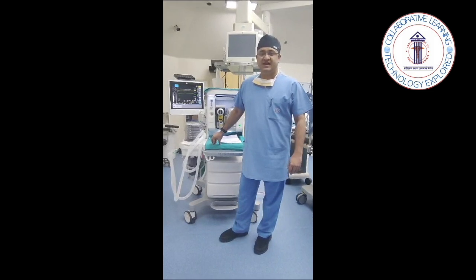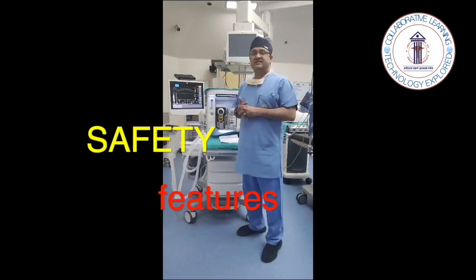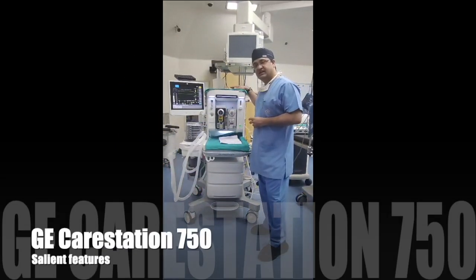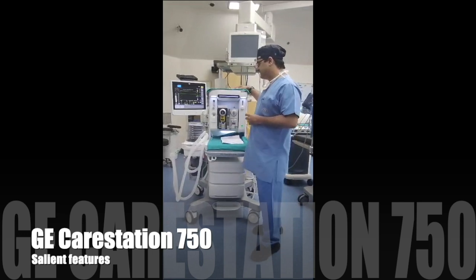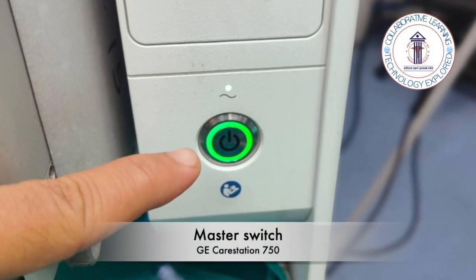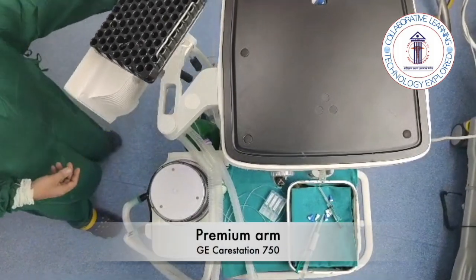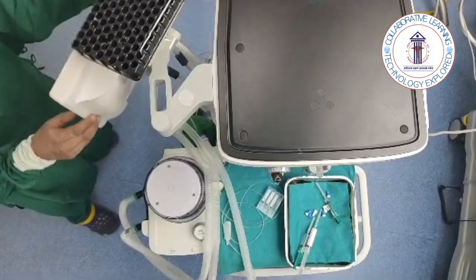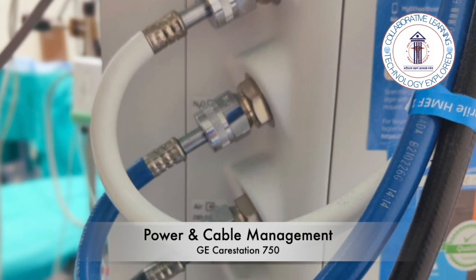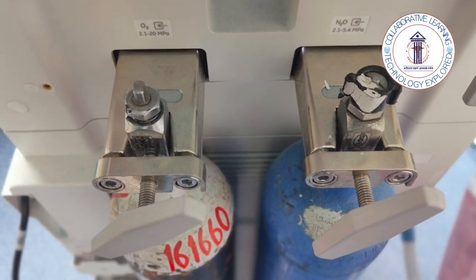The newer machines have a compact design. They are easy to use and they have tremendous safety features. The machine in question today is the GE Care Station 750. It has a number of features available: a simple power on and off button, a premium arm which can be rotated and used appropriately, efficient power and cable management, with gas inlets, pin index and cylinder yoke system, which is compact and yet very useful.